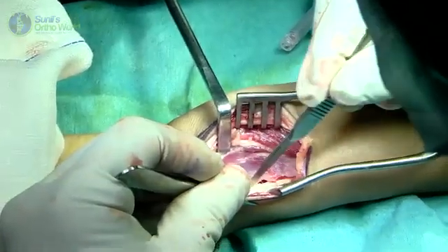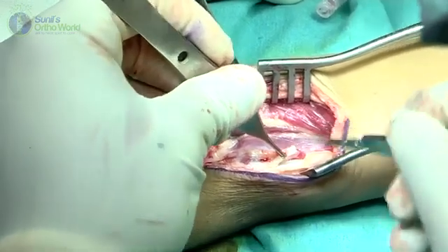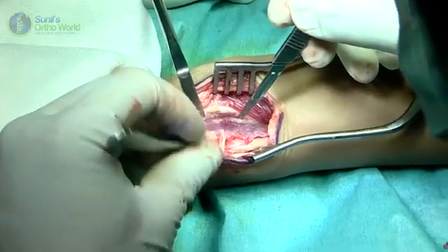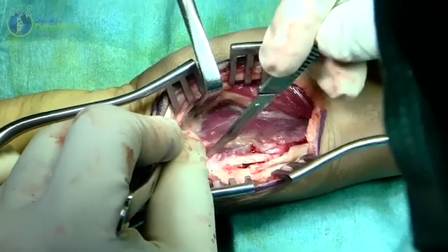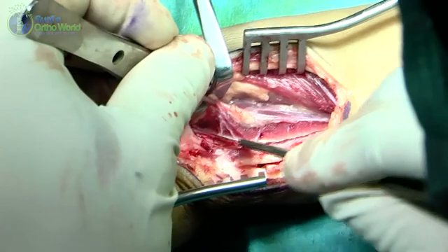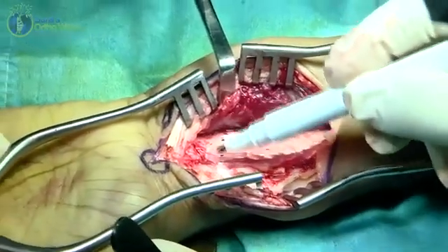A self-retaining retractor is placed proximally to retract the FCR and FPL muscles towards the ulnar side. Dissection then proceeds on to the lateral side to identify and mobilise the brachioradialis tendon. A Z-plasty of the brachioradialis tendon is performed so as to facilitate lengthening of the radius. The pronator quadratus muscle is then gently elevated from the volar radial cortex by using a reverse L-shaped incision, in a subperiosteal fashion from the radial towards the ulnar aspect, exposing the entire volar radial cortex.